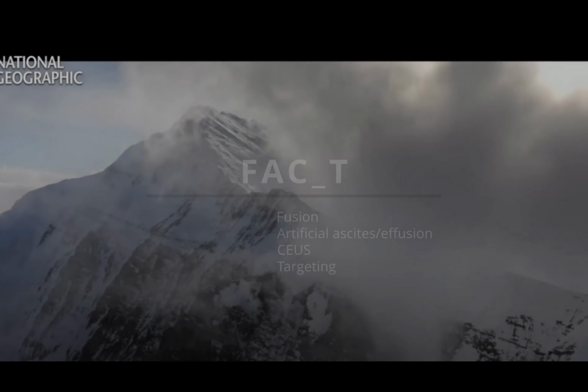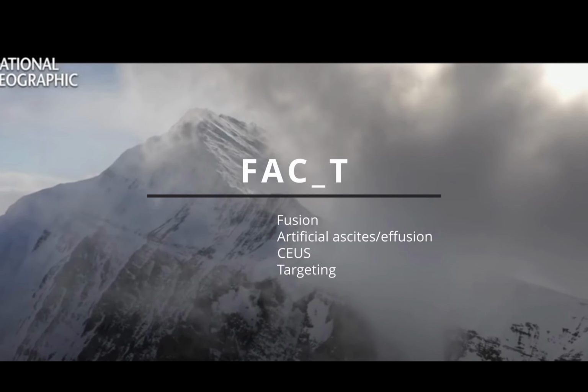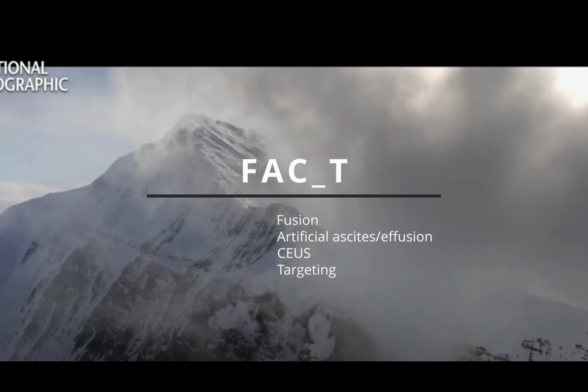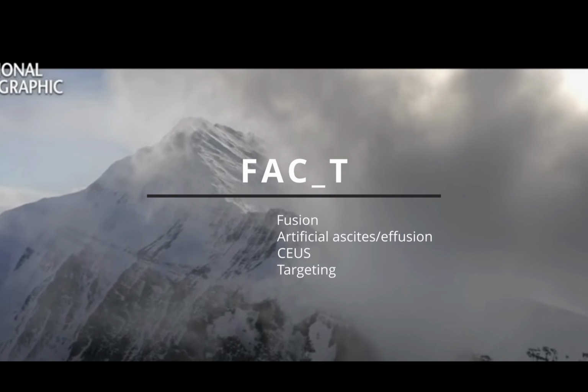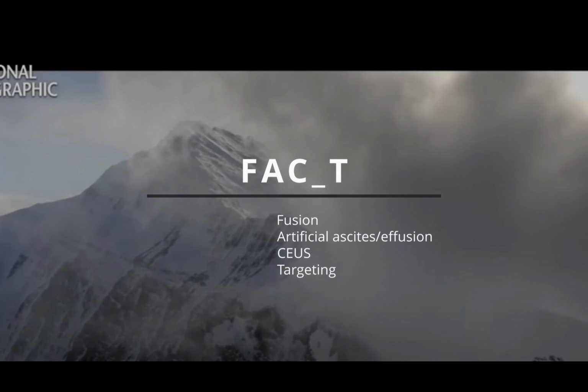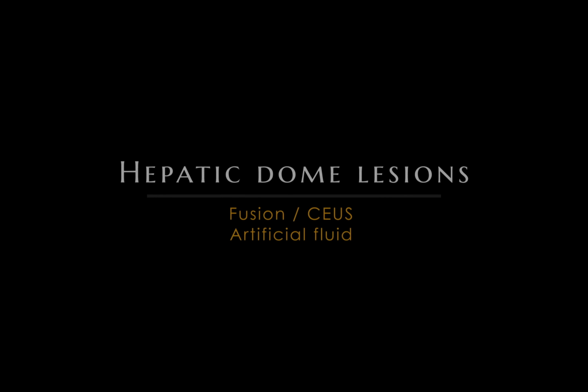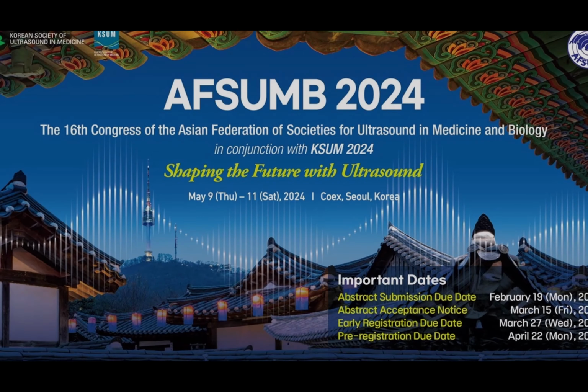So to climb the Himalaya is really difficult, but if you have preparation, we can do it safely and completely. Fusion, effusion, contrast-enhanced ultrasound. Hepatic dome lesion is not so easy, it's difficult, but we have good friends: fusion, contrast-enhanced ultrasound, artificial fluid. I think that's why I'm here.